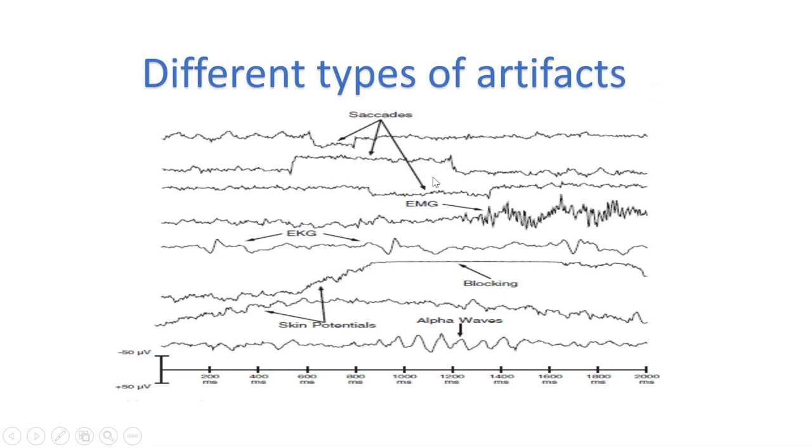So even I went back to the previous one again. If you look into this also, what I want to show is that the type of EEG you get will vary depending on what potentials it is recording. So if we carefully look into it, we can, to some extent, say what actually is contaminating our results.